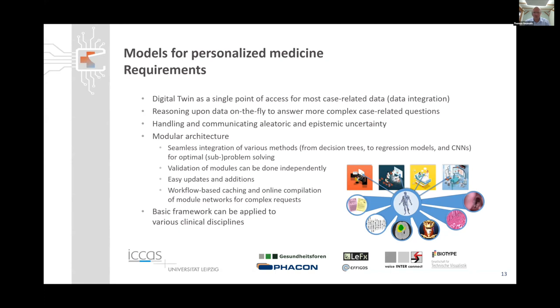But usually these measurement systems are very reliable. If we use infrared-based registration, we have 0.1 millimeter accuracy. So it's something that is really established in the medical domain, let's say, for 10, 15 years. So we have high trust in this. Okay, I'm sorry, it's just really for curiosity. You don't create a 3D model of the nose on the fly or something? No. This also takes too much computation time.